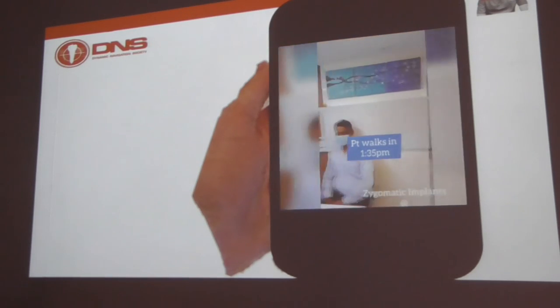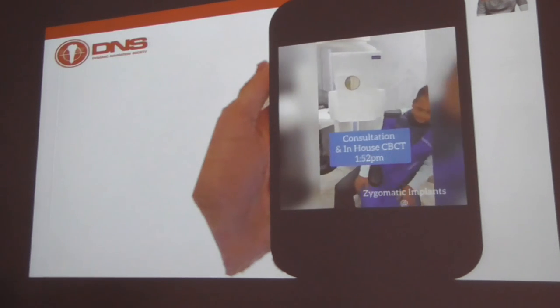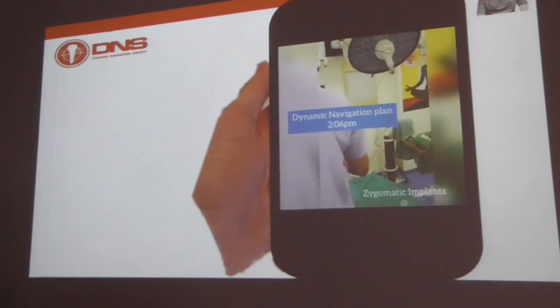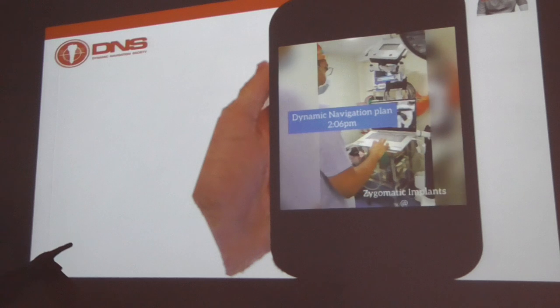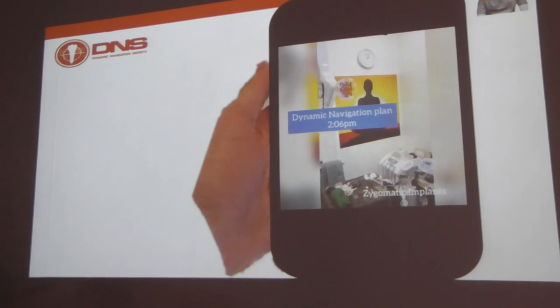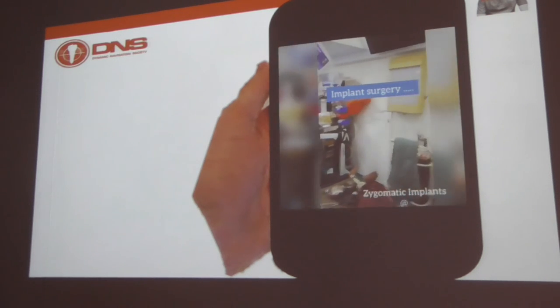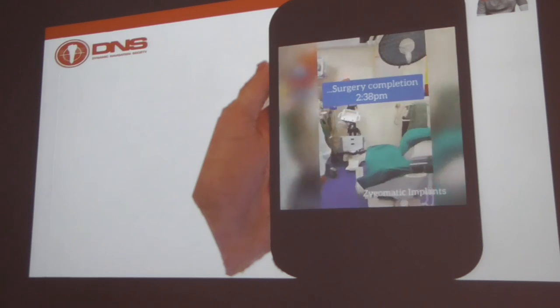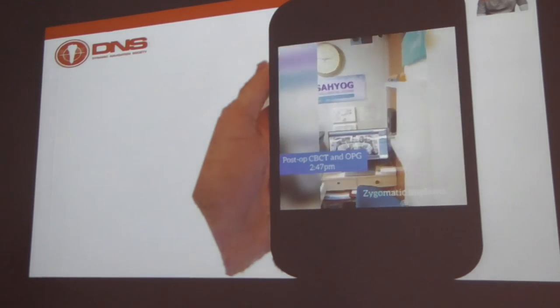This is just one video. If you all see, this is how I do zygomatic implants. Patient walks in at 1:35 p.m. I do the consultation, place the bone screw and take a CBCT. Patient walks into my operatory. I plan it next to the patient, place the implants by 2:30 to 2:45, and the patient is out with a zygoma within 90 minutes. So I feel this is only possible with navigation.